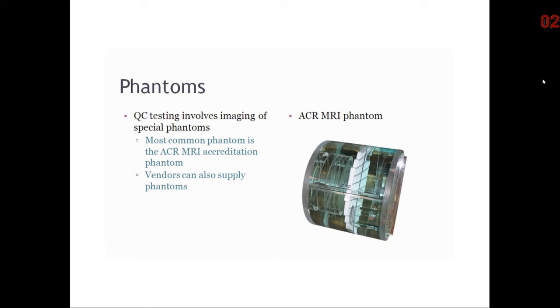The ACR phantom is a short, hollow cylinder made from acrylic plastic and is filled with a nickel chloride and sodium chloride solution to simulate biologic tissue relaxation properties. Structures within the phantom are used to assess many different performance parameters that affect image quality.